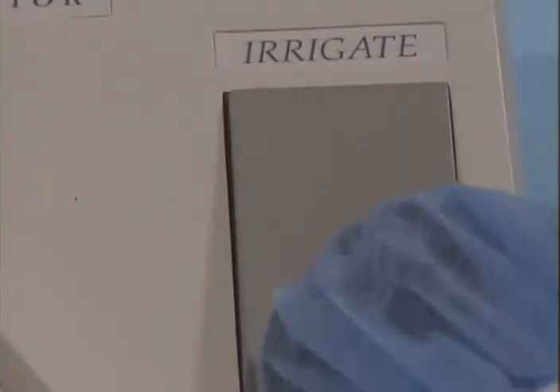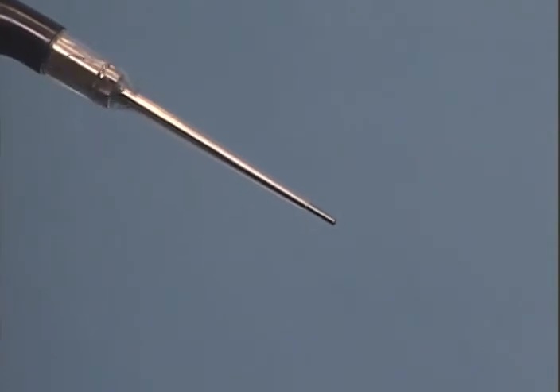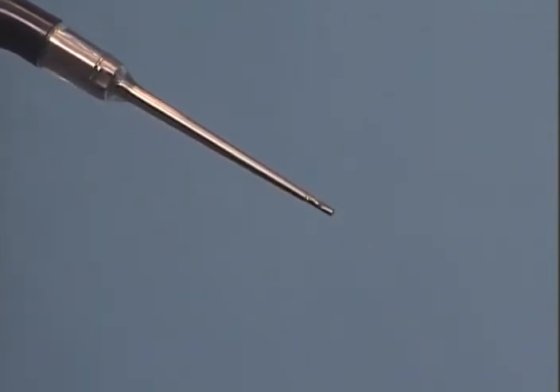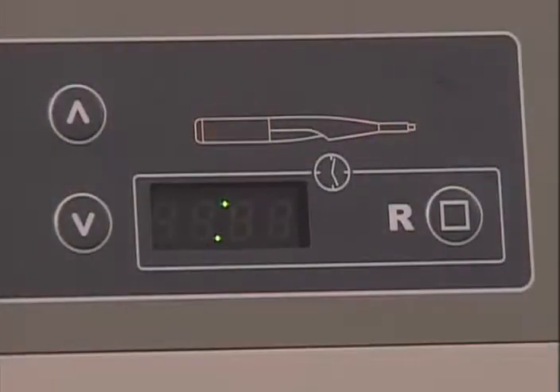Depress the irrigate pedal on the foot switch until fluid completely fills the tubing line to the handpiece and irrigant flows from the tip of the handpiece. Depress the power pedal on the foot switch for no more than 5 seconds to activate the handpiece. Check that both warning lights go out. Also, check that a fine aerosol spray appears at the tip, showing that ultrasonic power is present. The selector is now ready for use by the surgeon.